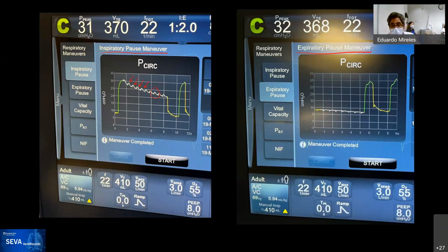Rob? No comments that we haven't discussed. Excellent. Any comments on the line? Yeah, this came up with COVID a lot, with patients with unresolvable leaks, and you're trying to get a plateau pressure, how is this completely unreliable now? Do you just go after the very first thing? It's very hard, right? I'll ask the audience, can you measure plateau pressure in a patient that has a leak?